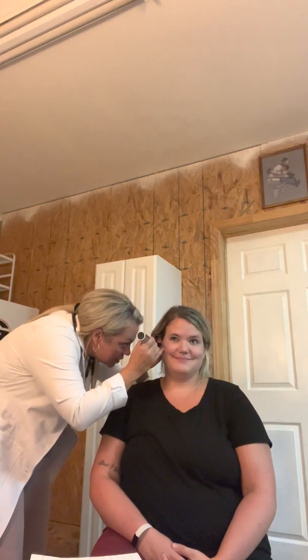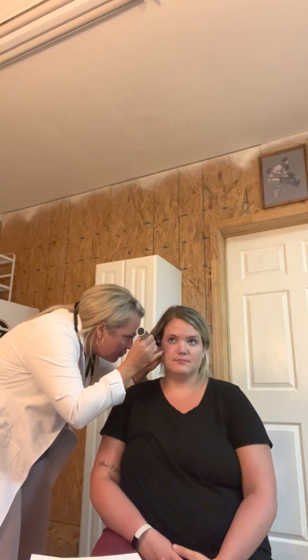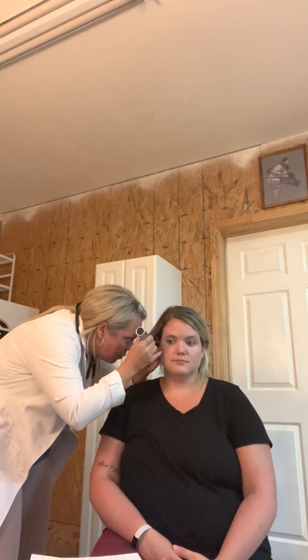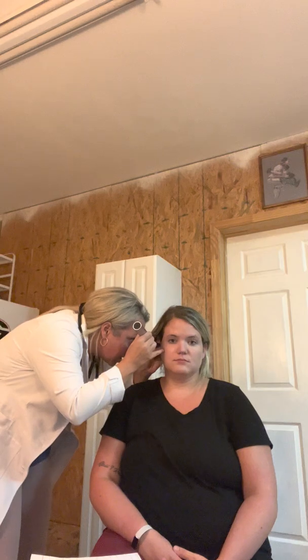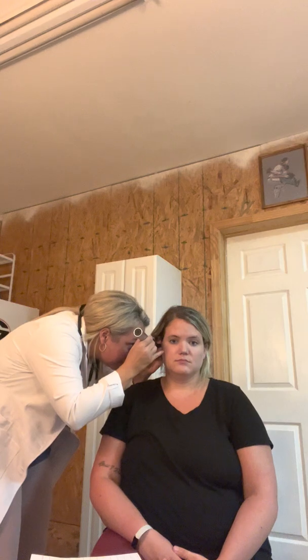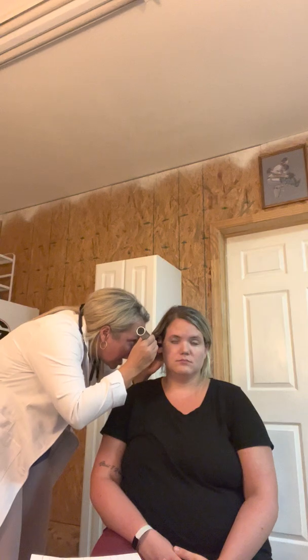All right, so I'm just inspecting the ear canal. I see a small amount of earwax. There are some fine hairs on the outer surface of the ear canal. I see the tympanic membrane. It's translucent and gray. The tympanic membrane is moving in and out, which is a normal finding. I can see the incus located behind the tympanic membrane. And this is the right ear, and the cone of light is at 5 o'clock.